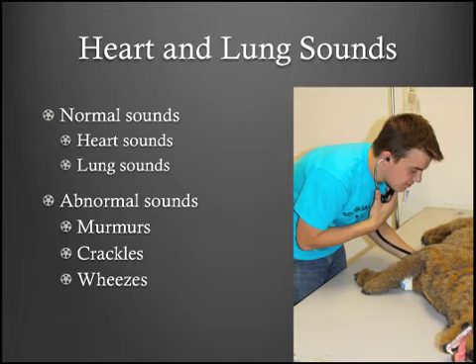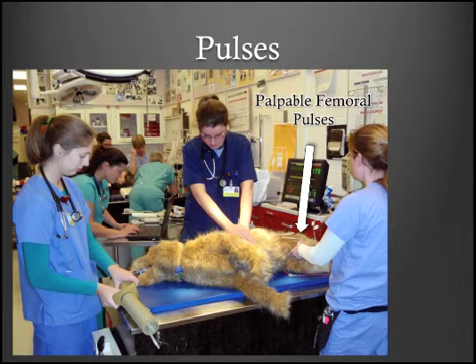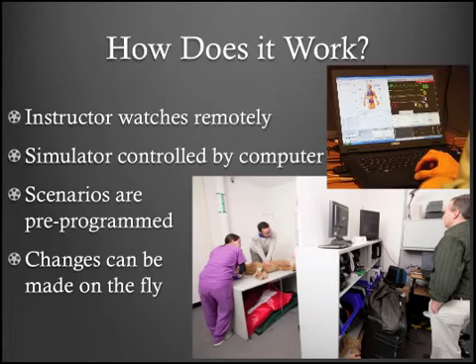All of these sounds are synchronized with patient chest excursions and the waveforms on the patient monitor. Bilateral palpable femoral pulses synchronized to the patient monitor are also present. The instructor watches remotely, controlling the simulator with a computer using pre-programmed scenarios that can be changed on the fly if needed.